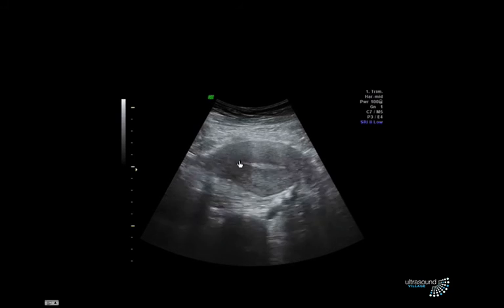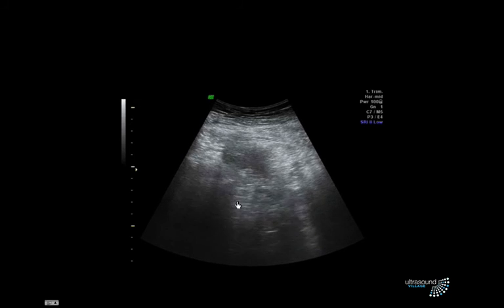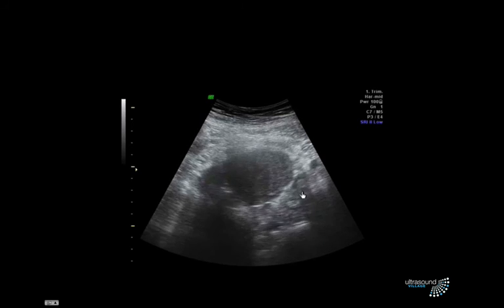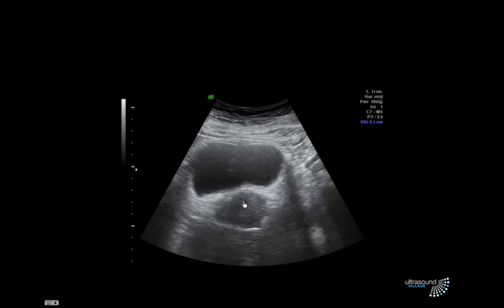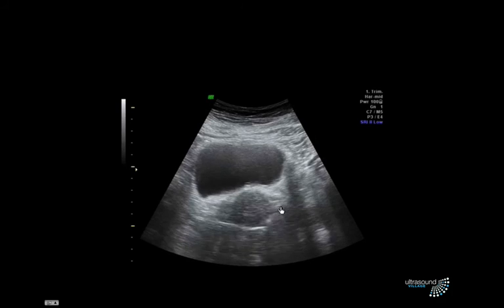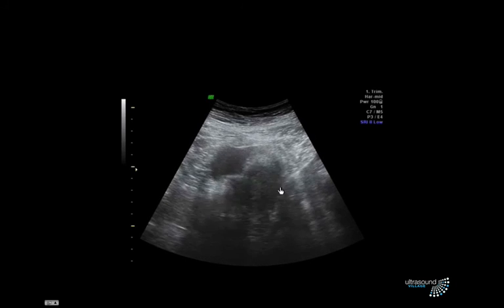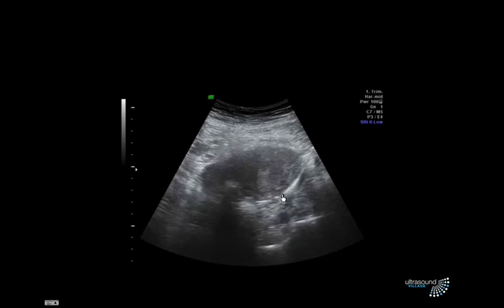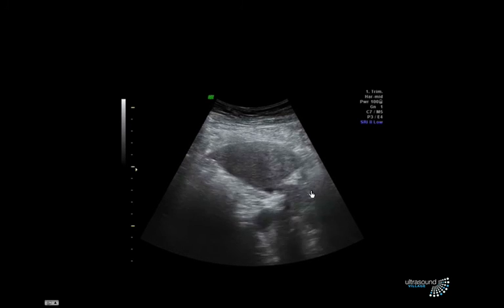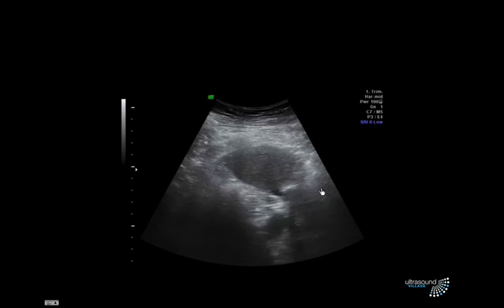Here we go through the uterus and out through the top of the fundus. Once more, down through the fundus, endometrium here, down, down. This is all bowel gas behind. Down we go through cervix, here, vagina. Those are ureteric orifices, and this is the bladder. Transverse scanning. I know now we've viewed that uterus in its entirety. We haven't missed anything, and we probably haven't missed anything huge in the uterus or in the pelvis as a whole.